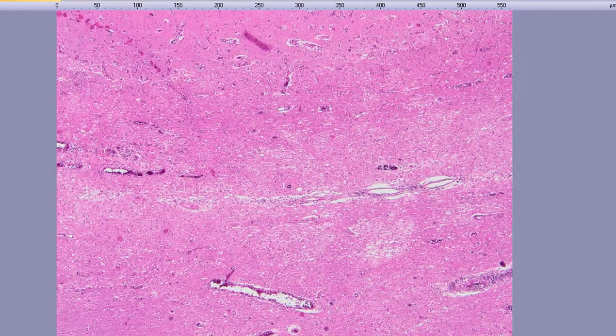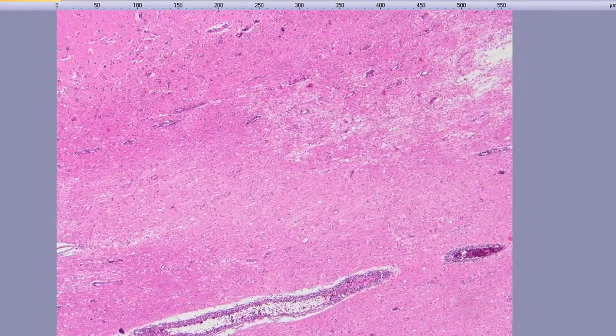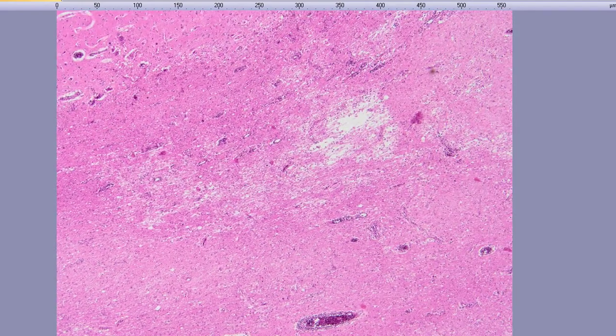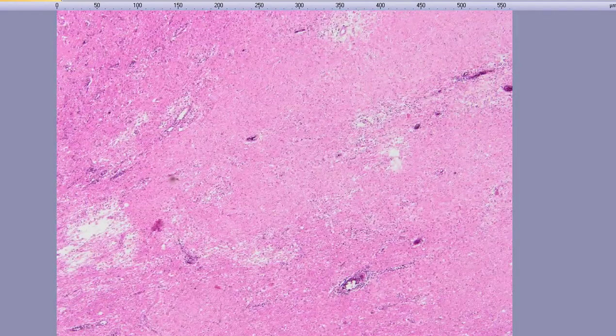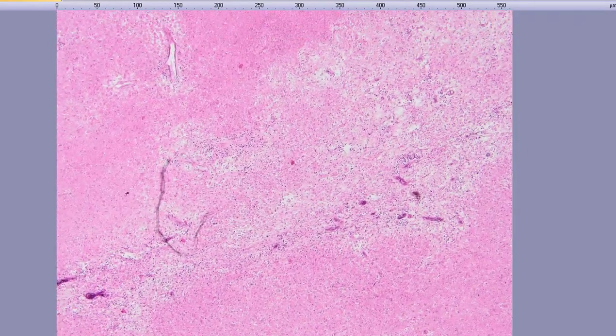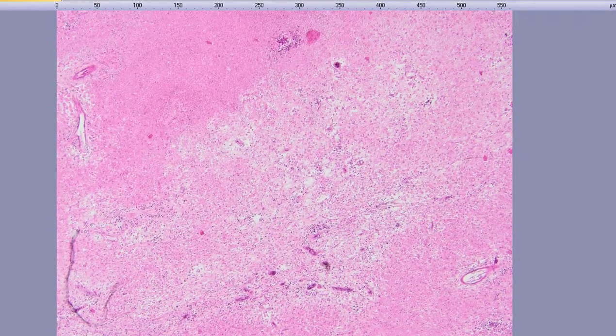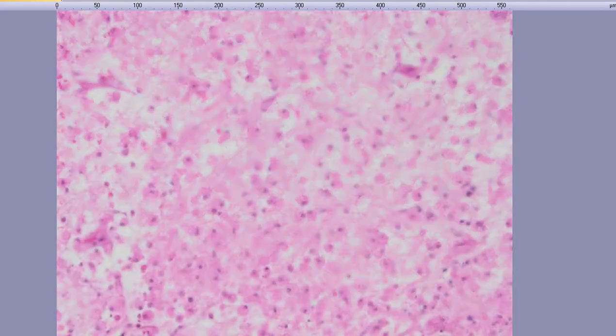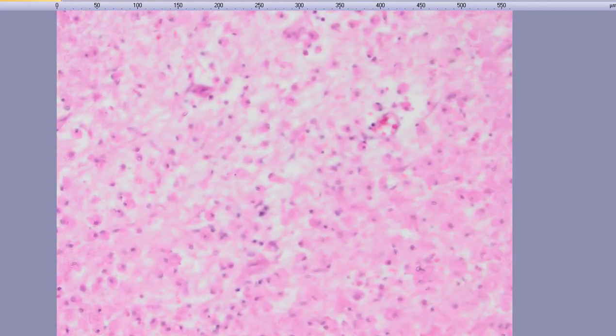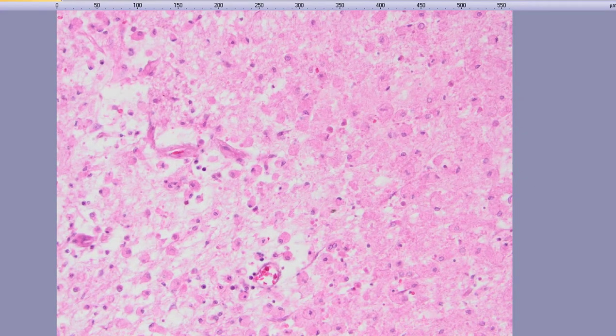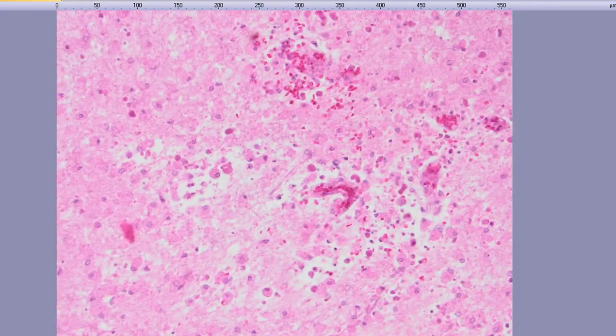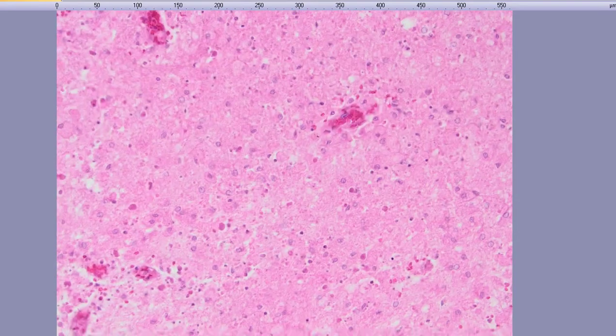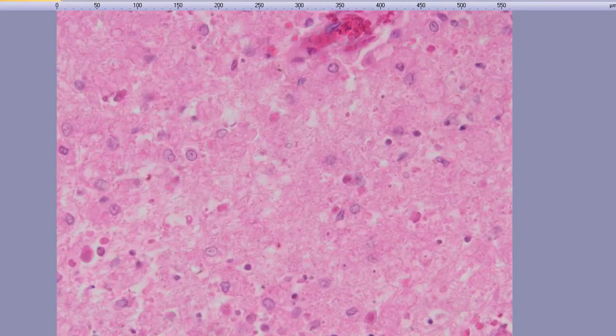I'm going to continue moving. You can also see perivascular inflammation, as I said, areas of tissue necrification and disintegration. These are actually areas with, you can see, a lot of macrophages, probably microglial cells. There is tissue necrosis here.